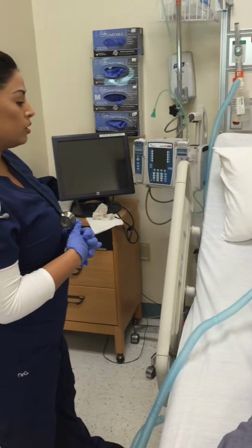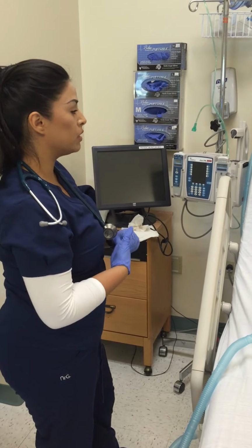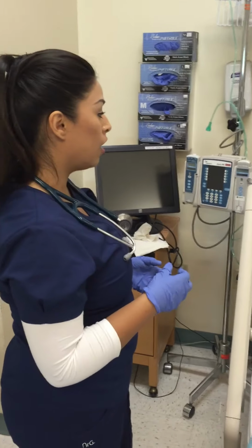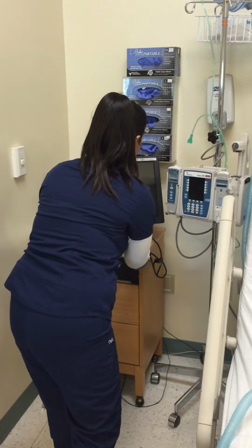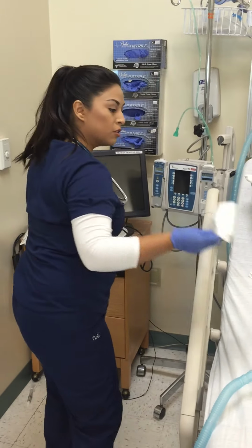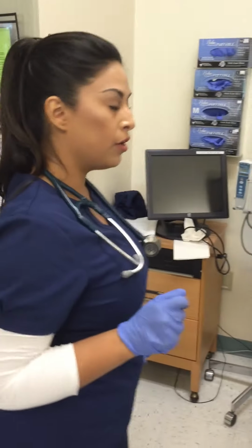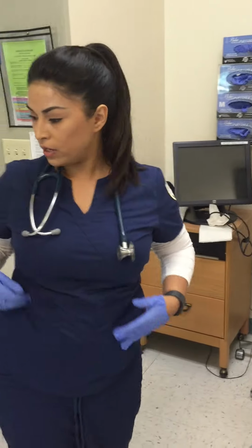It should take about 15 minutes to go in there and relieve some of that swelling you have. If you have the urge to cough, you can just take it off, and I'm going to give you a tissue in case you have to get some of those secretions out, okay? I'm going to check your oxygen really quick, so I won't make you get out of bed all over again.